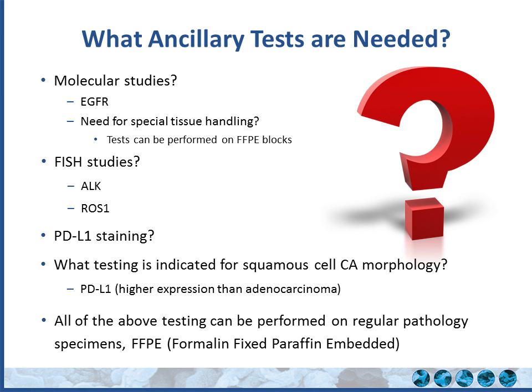It's rare. As I said, even in our practice, we get maybe one a year, but our oncologists are so enthusiastic about treating patients with ROS1 because there is a target, crizotinib is one of the drugs, that we always get ROS1. And then PD-L1 staining. It's kind of all the excitement, all the rage nowadays. Yes, we do get PD-L1 staining.